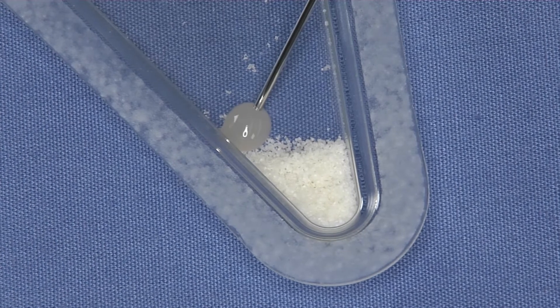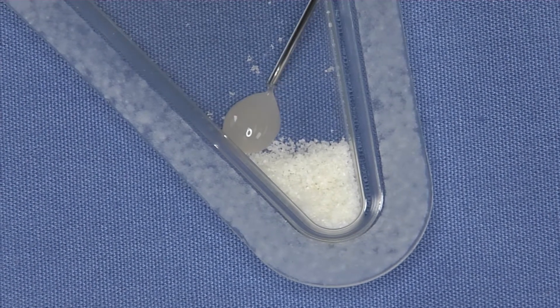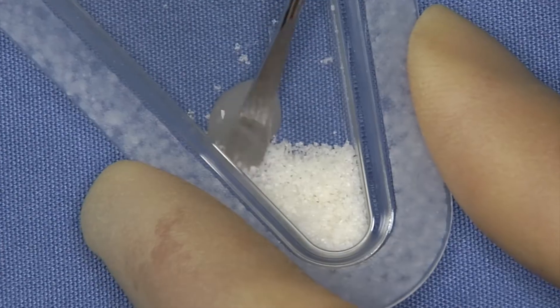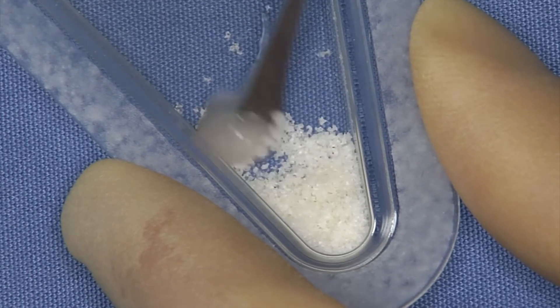The intraosseous component of the defect is filled with bone substitute, premixed with Straumann Emdogain.